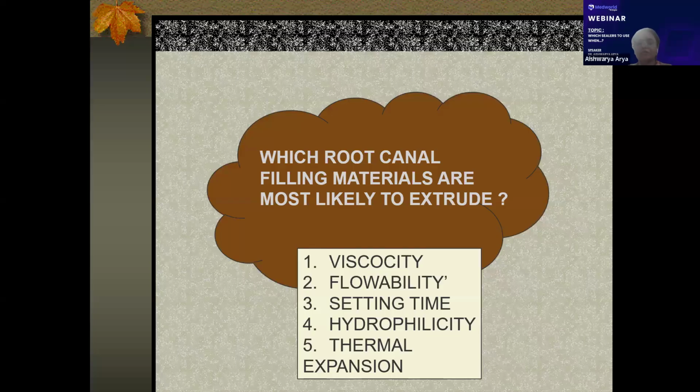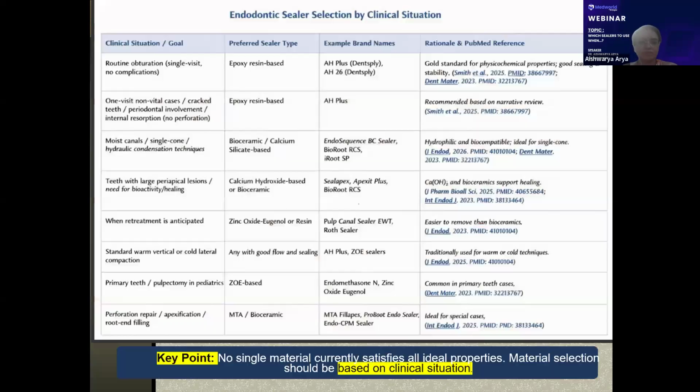Now, which root canal fillings are most likely to extrude? That depends upon the viscosity, the flowability, the setting time, the hydrophilicity, as well as the thermal expansion of the sealers and the root canal filling material that you're going to use.